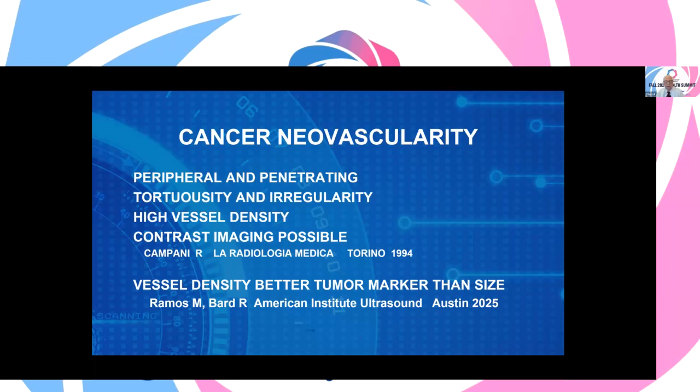So finally, after looking at babies, we started looking at the uterus, then we looked at the breast, and then the abdomen. And then we got into vascular imaging specifically because the blood vessels are everywhere in the body. So you have a map of whatever's going on. And then we are able to look at normal versus abnormal vessels.